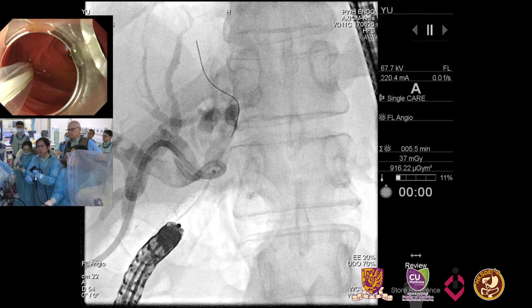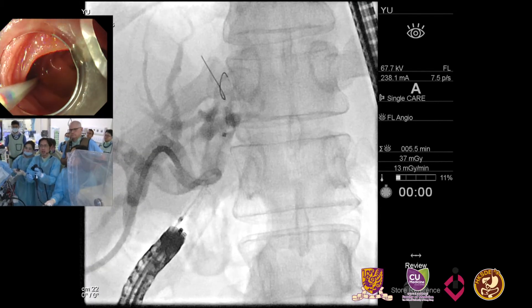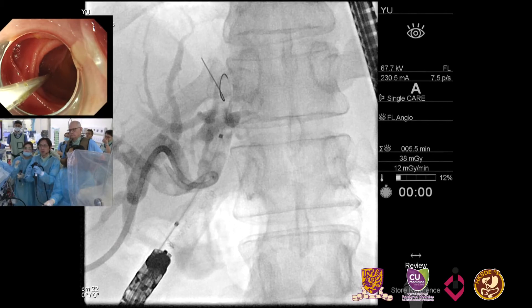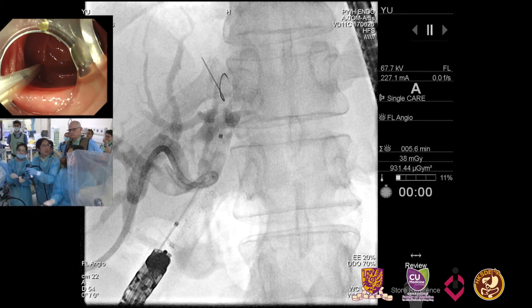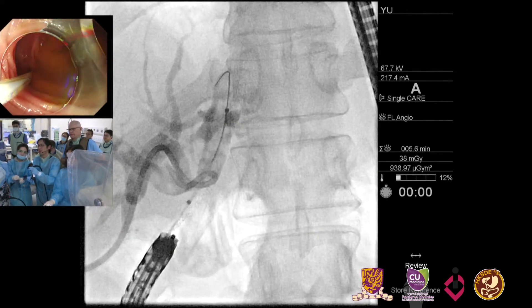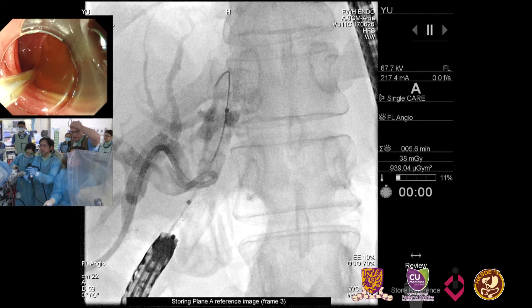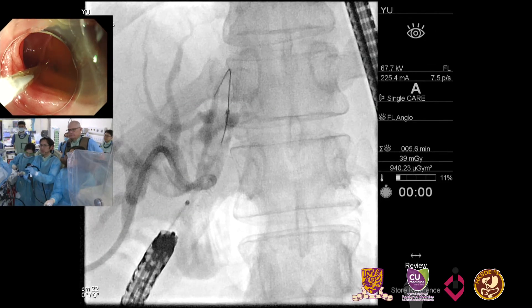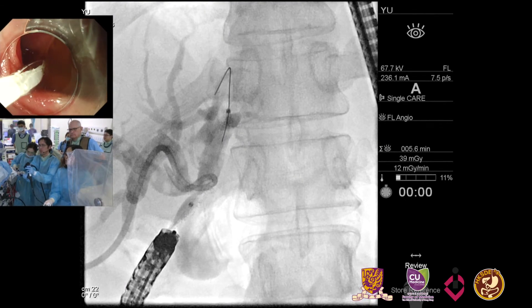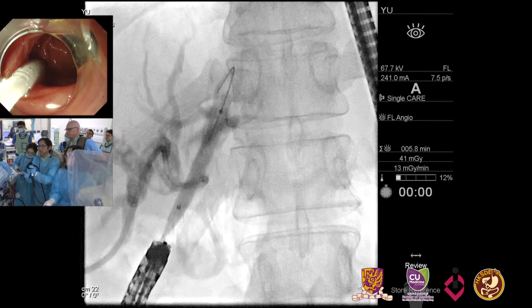There was some resistance getting the balloon in, so I think these filling defects may be real stones. Raymond, the procedure is almost finished. Thank you for your beautiful demonstration. We will now go back to room 4 and because time is short, we may not continue the live demonstration on your side.